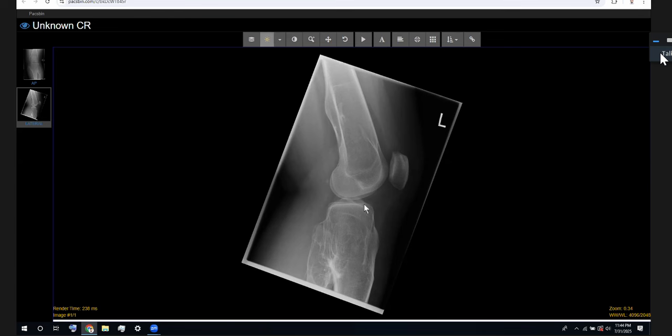Any acute neurologic symptoms, and also compare with the previous imaging for the study. That's the key thing, isn't it? To compare with the previous, because usually this will be a known condition. They would have presented before and they will have had loads of x-rays. So you want to compare with previous to see if there's any drastic change radiologically. But then also, as you say, you want to ask clinically, has there been a change? Is there new pain? Because that is another red flag.